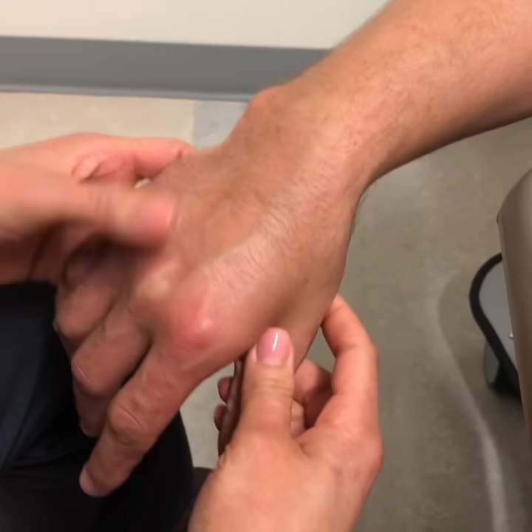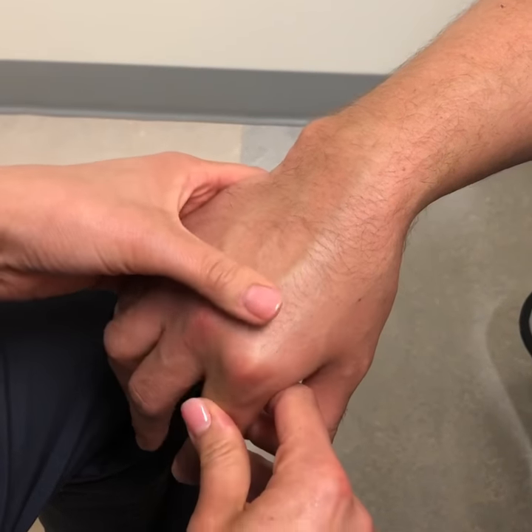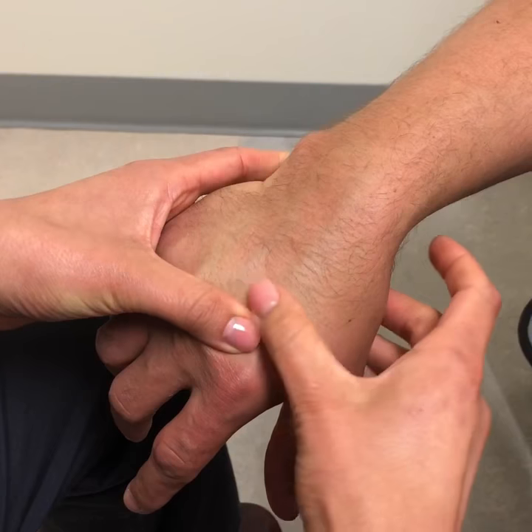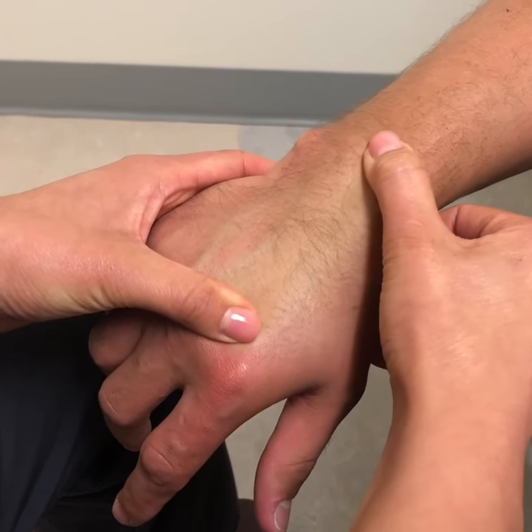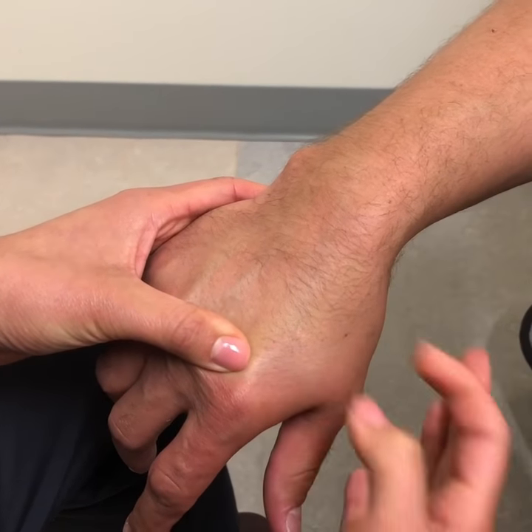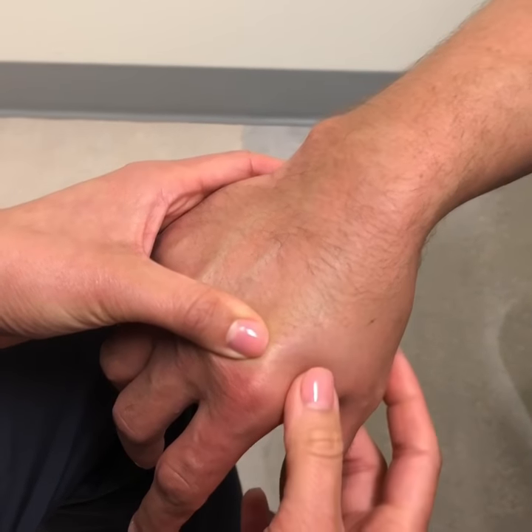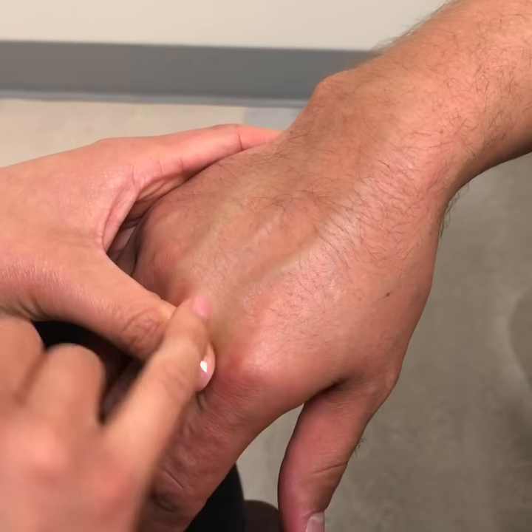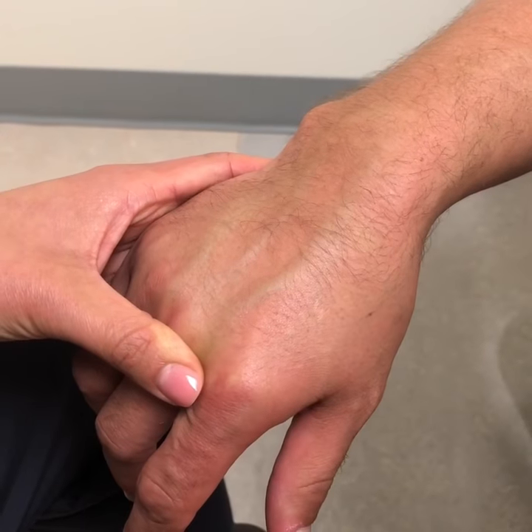When you're looking for a valve without the tourniquet on, you're going to place your thumb distally to whatever vein you're looking at. With the other thumb, you're going to push the vein up pretty hard. As you can see, there's a valve there and a valve below my thumb, because when I let go the vein appears. So you're not going to want to go right here or right there, because those locations have valves.